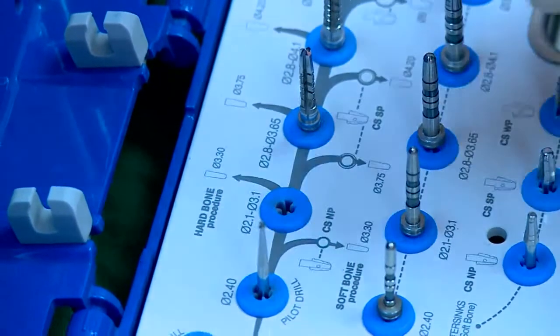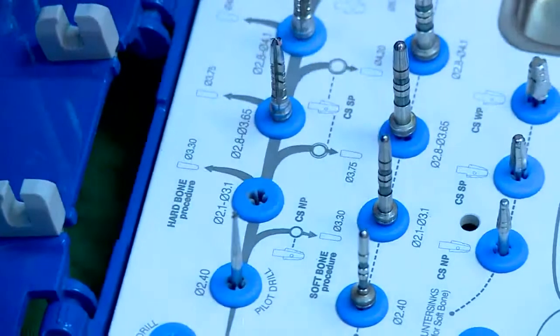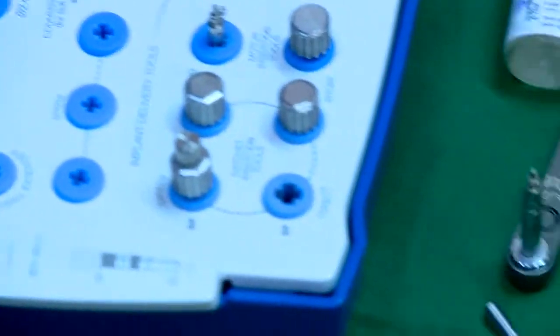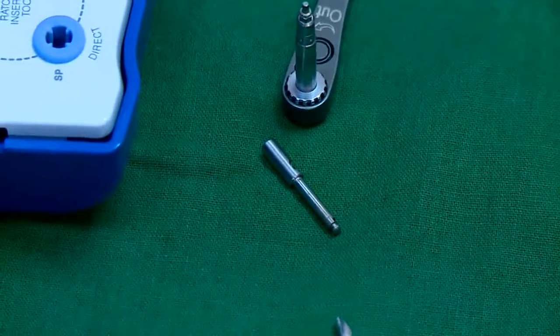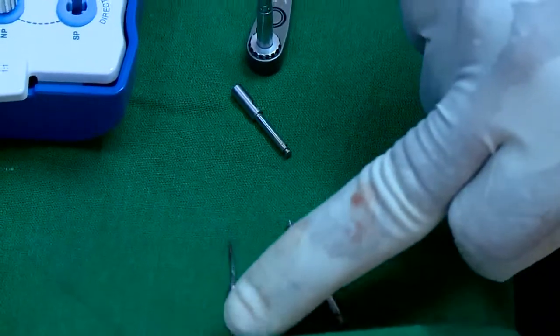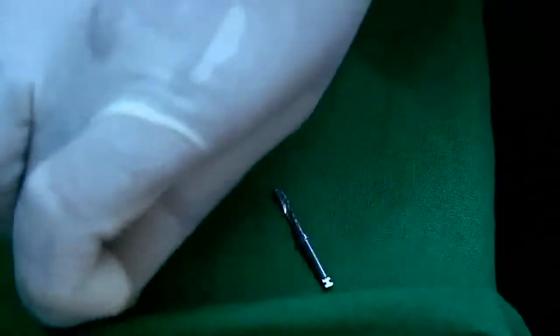Okay, now I'm going to go to the next. My first drill will be a 2.4 drill, which I just took out. This is a lancet drill. You can see the drills where I'm keeping them here. The lancet drill, which I used first to pierce, is like a knife, it just goes in and out. That does not prepare the osteotomy site, but it gives the direction.